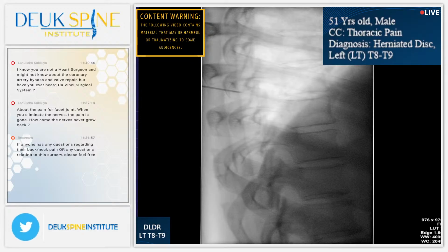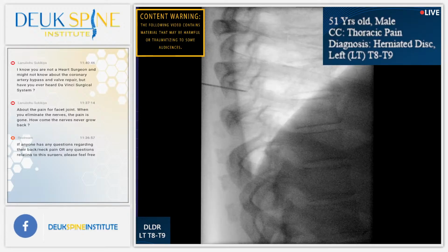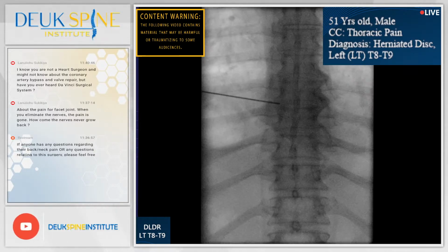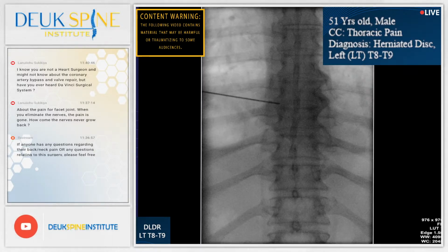That's, I think, better. Yeah, that's better. All right, so AP, question is, are we too medial? And therefore, we're not able to get around the spine. Quick AP. Shot. Yep, too medial. That's good. That answers that question. So we need to reposition.